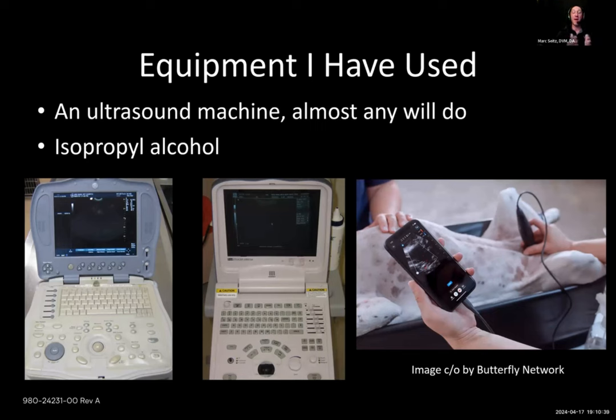It reminds me of when we all got video otoscopes and we wowed clients with these. Clients are just blown away when you pull an ultrasound out of your pocket and you start using it. So do not break the bank if you're limiting your scanning to point of care. Now, if you're looking to do diagnostic, we do need to have other equipment considerations, and that's fair too.